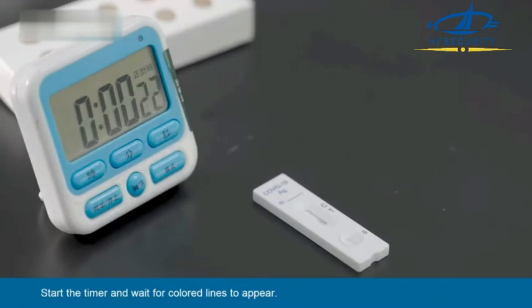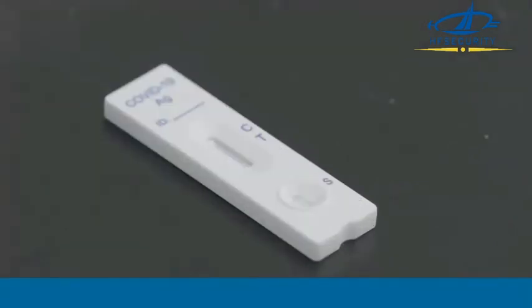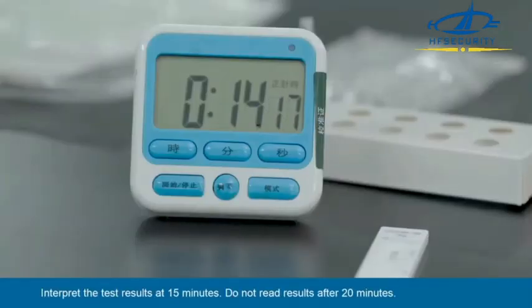Start the timer and wait for colored lines to appear. Interpret the test results at 15 minutes. Do not read results after 20 minutes.